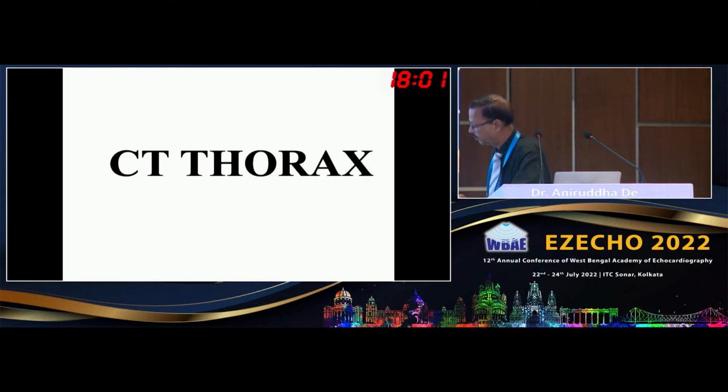On the echocardiogram, if it was an aortic aneurysm, you wouldn't have this kind of low velocity swirling flow. So why do you expect a pseudoaneurysm or aneurysm? No, I think there could be some AV communication, and what we are seeing is probably the AV communication. Where? Of the subclavian artery with the subclavian vein or something. That could be, it is a possibility.